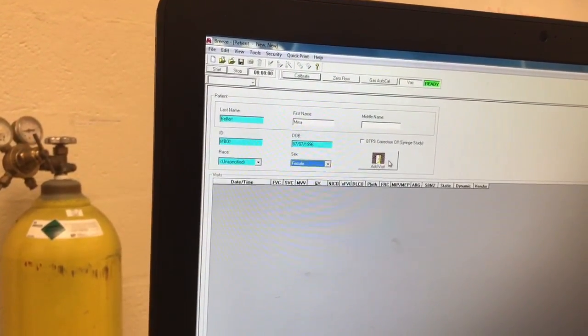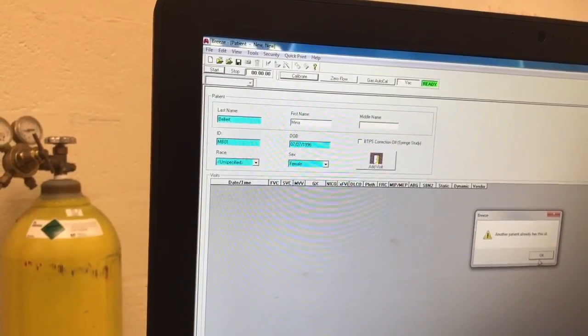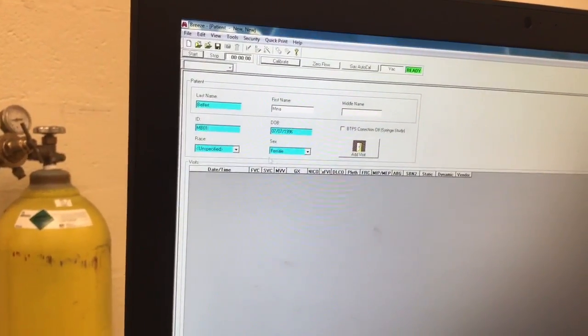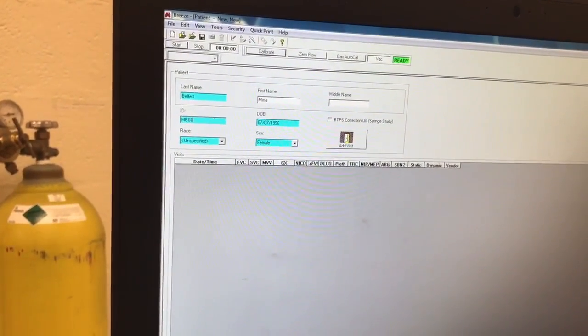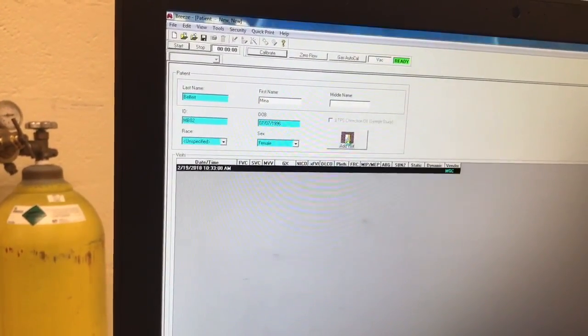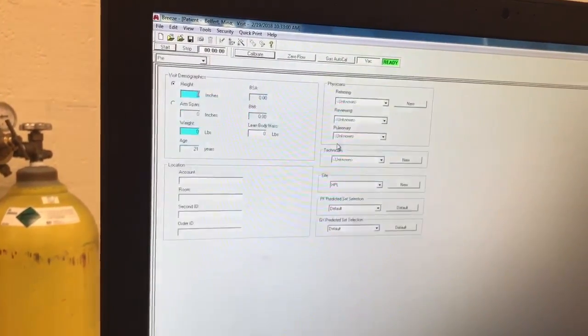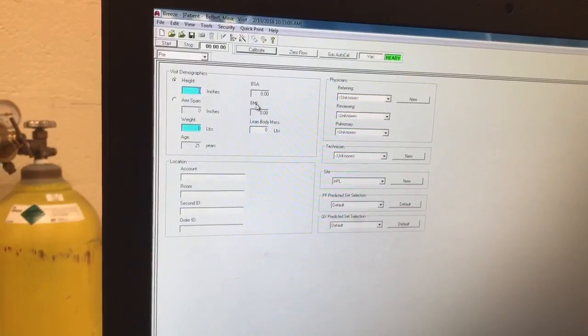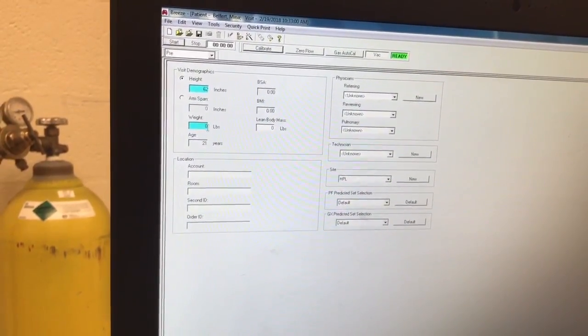Then click add visit and fill in the remaining highlighted boxes.